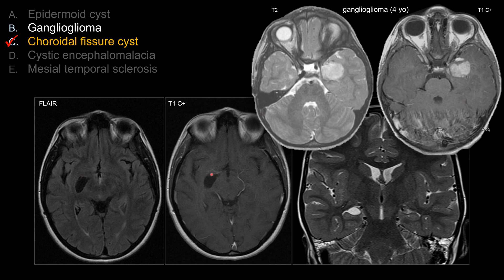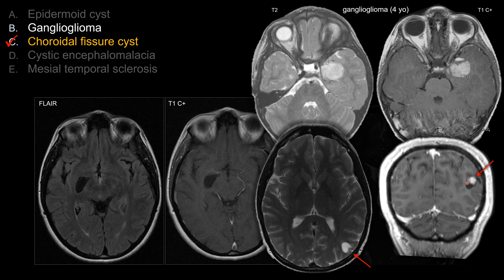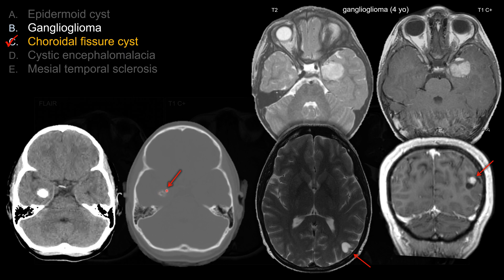When you look at the lesion, you may think it could represent a cystic neoplasm. However, on T1-weighted or post-contrast sequences, there is absolutely no enhancement and no enhancing mural nodule. Contrast that to other neoplasms — for example, ganglioglioma, which is a low-grade lesion, WHO grade 1. It does typically present in the temporal lobe; however, you should see an enhancing component. Sometimes it's solidly enhancing. It may also show a cystic lesion with an enhancing mural nodule, and it's one of those lesions that can calcify. If you see calcification with a cystic lesion and an enhancing mural nodule, consider ganglioglioma over, for example, pilocytic astrocytoma, which also likes to show a cystic component with an enhancing mural nodule.